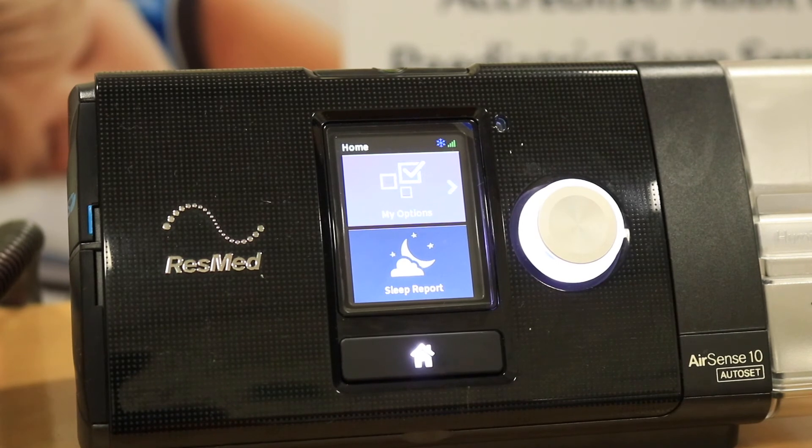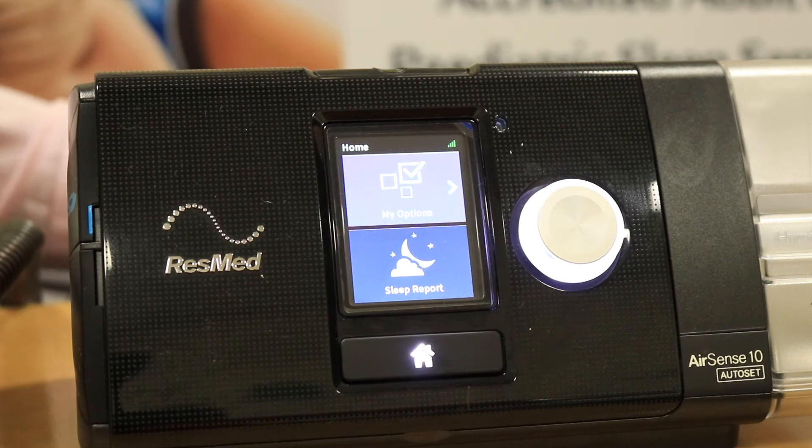When your mask is sitting nice and comfortably on your face and you think you have a good mask seal, the device has a function that allows you to test your mask seal to ensure that you're getting a good seal. Go into the Run Mask Fit section, which is located under My Options.